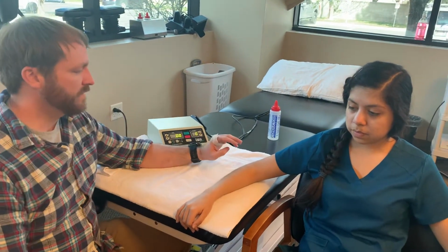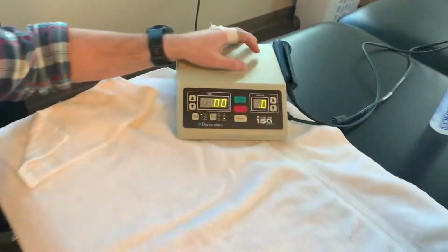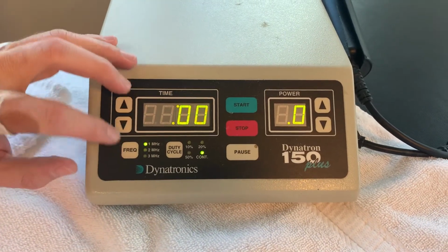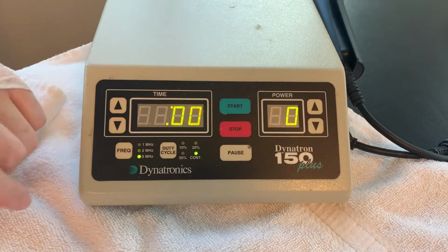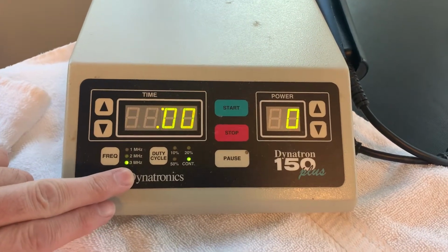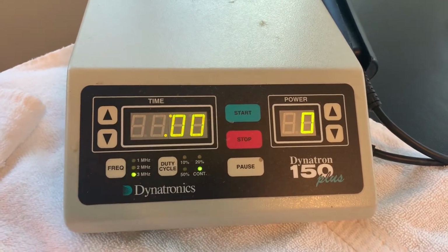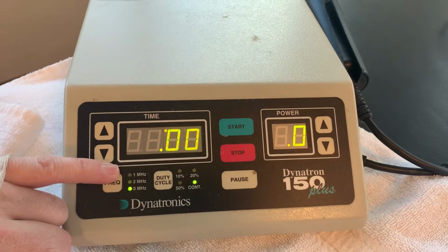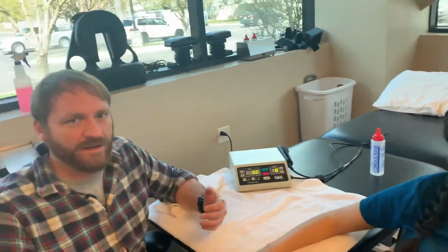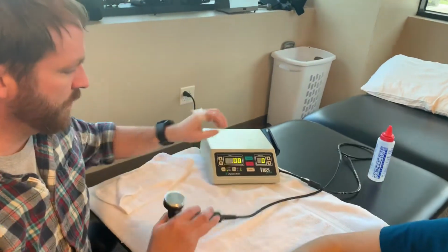So since the lateral epicondyle is relatively superficial, we're going to go with a much higher frequency, shorter wavelength when we're picking our frequency. So we're going to go with 3 megahertz, depending on your unit. 3 megahertz should penetrate about 2 centimeters into the skin, up to 2 centimeters, I should say. And a 1 megahertz, which we'll discuss in a minute, will penetrate up to 5 centimeters, depending on the impedance of the tissue that we're going through. So with this particular case, we're going to go with 3 megahertz.